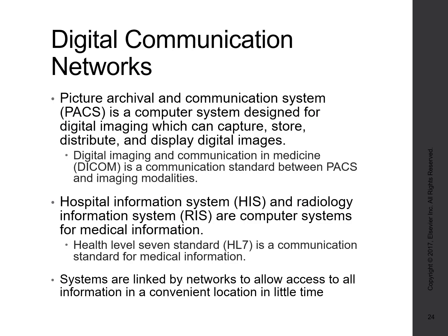Okay, so this brings us to the next topic, which is our digital communication networks. Now, this is not exciting, I'll tell you, to me anyway. For some of you it may be, but it is essential. And what will often happen is that you'll be working with these systems and not really understand or even recognize what you're working in. They're so entwined in what we do with all of our imaging that sometimes it's hard to recognize where one system starts and the other one stops.